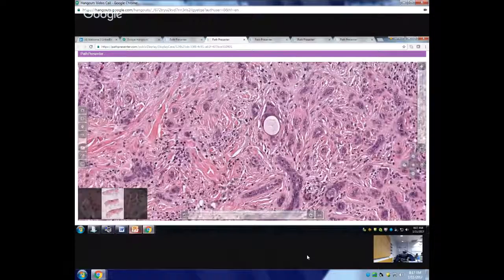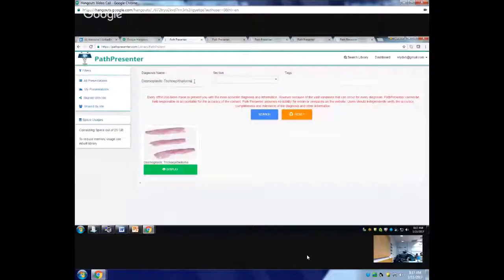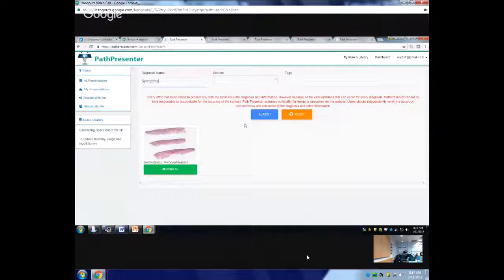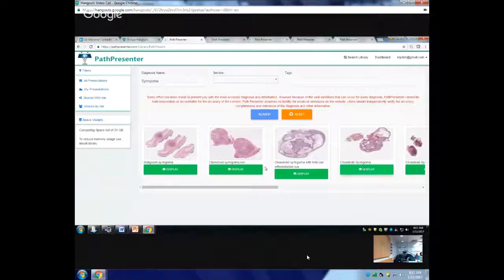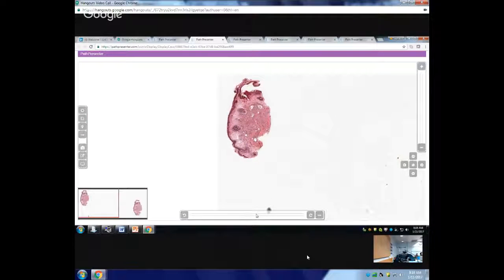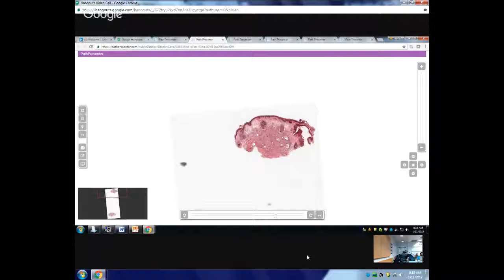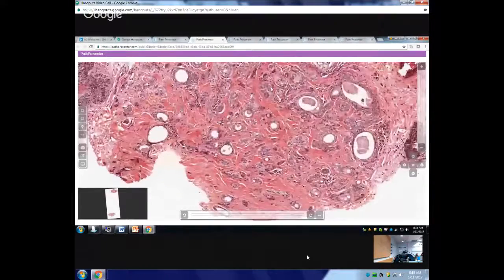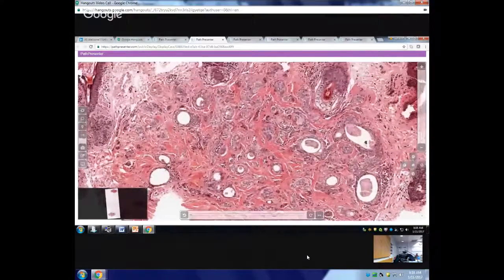We are going to look at a syringoma, but I can show you a syringoma right now actually, because you see this and then you see that. So like look at this. This is a syringoma now. So we don't see any hair structures, but what you actually see, these are actual glands.